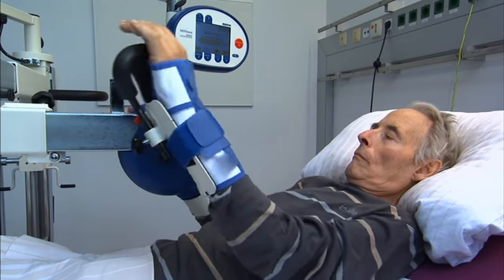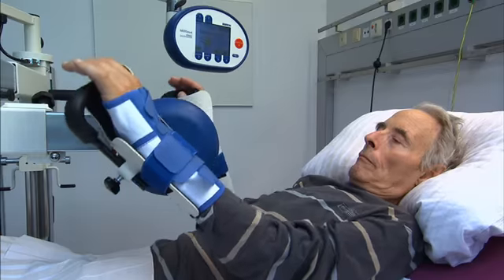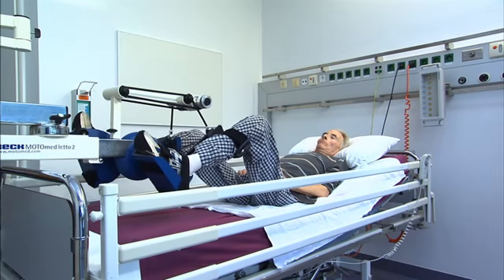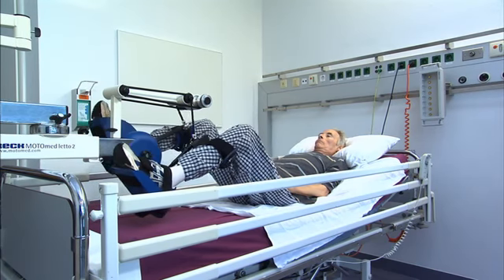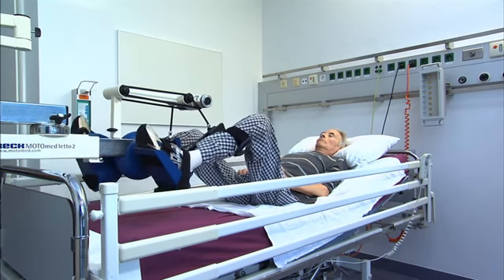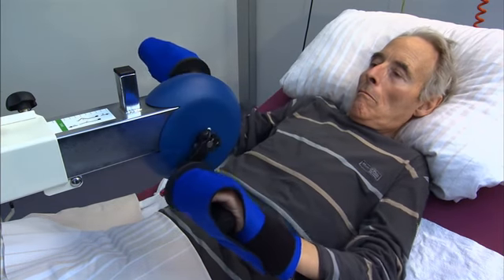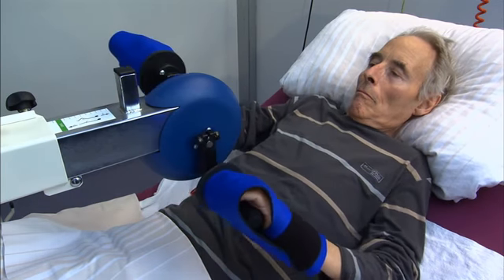Many important physical functions are dependent on regular exercise and movement. Elderly people experience a reduction in physical functions even after 24 hours lying in bed. Lack of movement can, for example, cause respiratory problems, deficits in blood volume, problems with joints, and mental problems. This often triggers a vicious cycle.